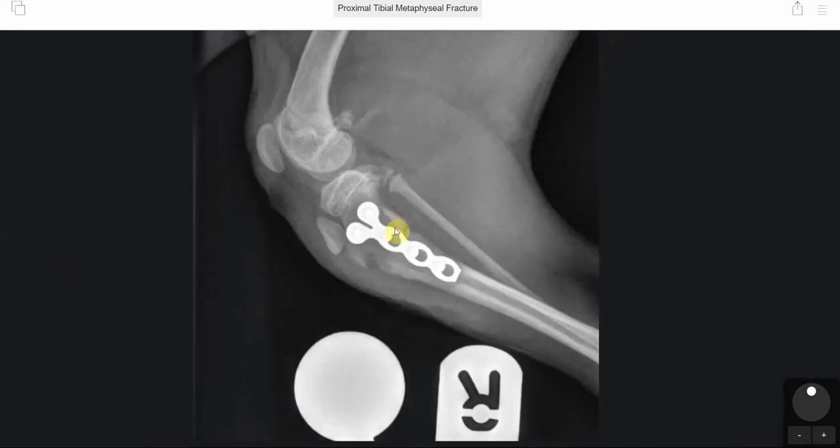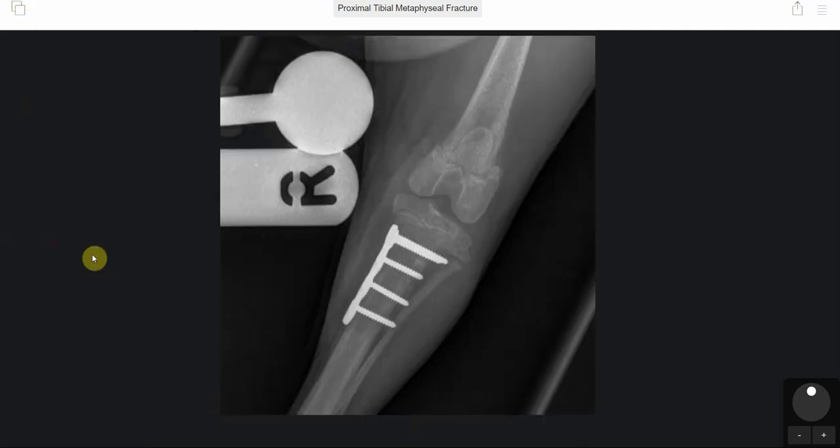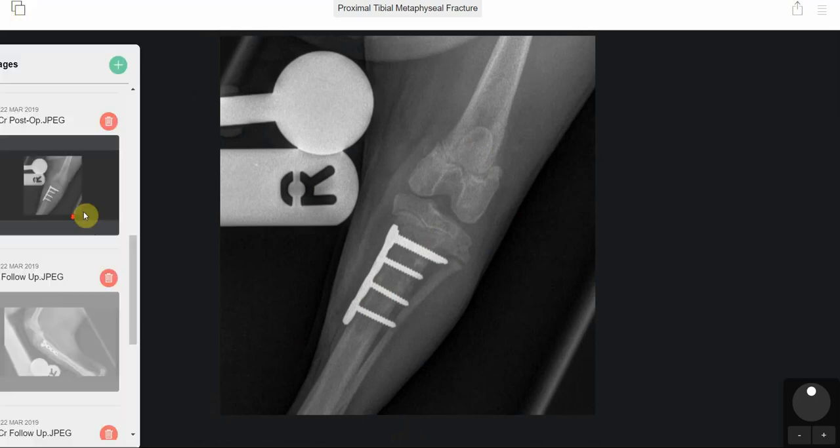In the post-op x-rays, you can see that we managed to put the 2mm notched LCP plate on to repair the fracture. And in the caudocranial view, we were pleased with our alignment and also managed to get the fracture lined up properly at the time of surgery.